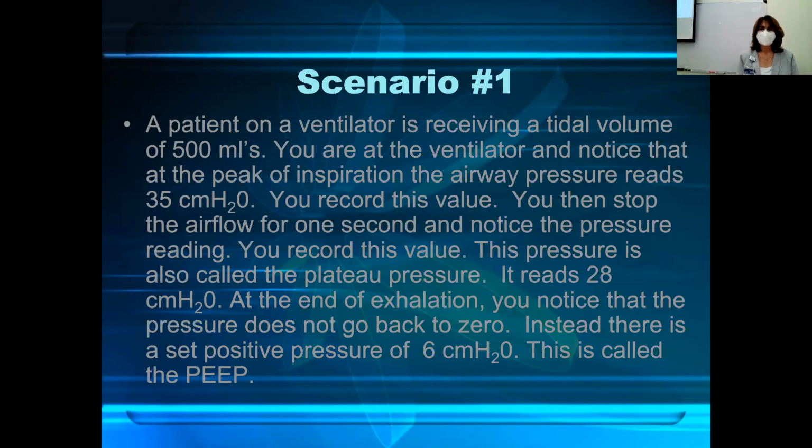So normal for static compliance, 40 to 60 mLs per centimeter of water. Same concept though, if it's lower, it's higher resistance. Or, yeah, high compliance is better, and low compliance, yes. So a number higher than 60 would be high compliance. A number lower than 40 would be low compliance.